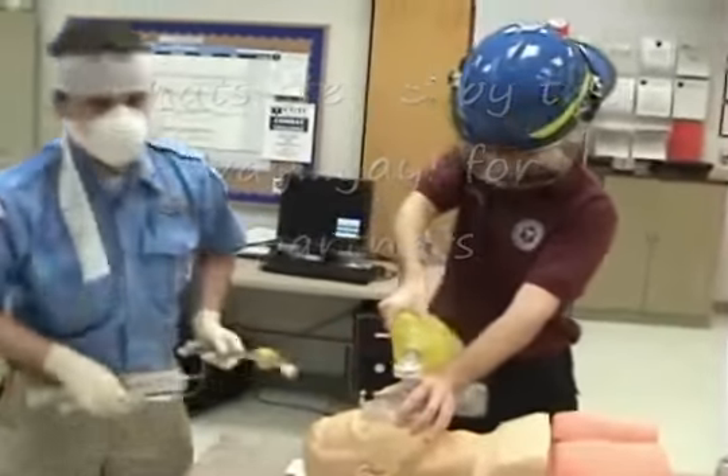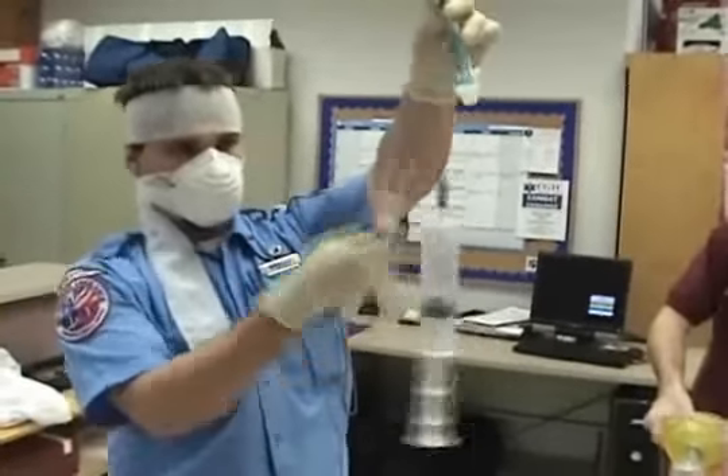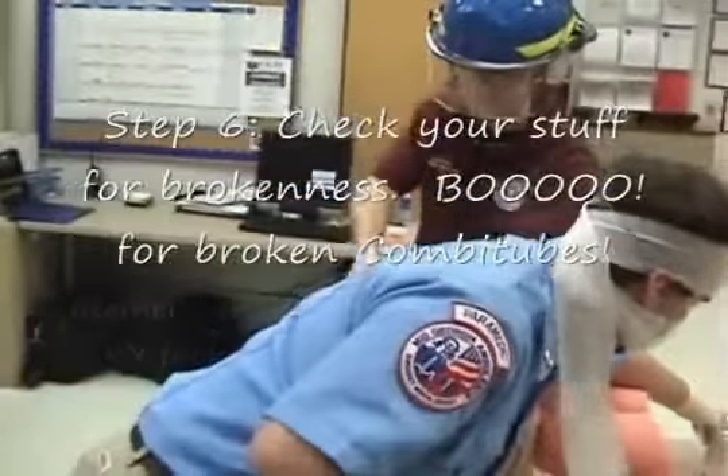Then I'm going to get all the stuff that I need — you've got to have some stuff. You need a Combitube, a big syringe, a little syringe, and some lubrication.